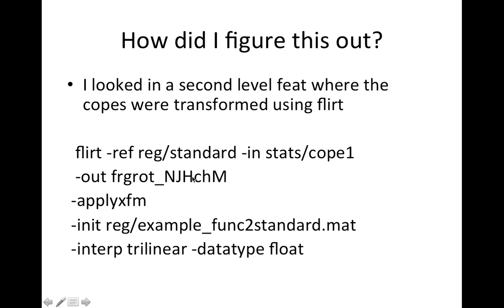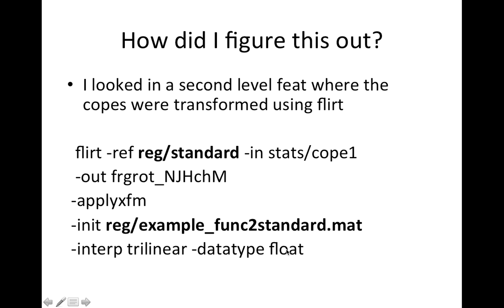The output is a temporary name, because all the copes once put in standard space are concatenated to make a 4D file — the filtered_func_data in the second level analysis. The rest of the FLIRT call uses 'applyxfm', which says just apply this registration .mat file. The .mat file it uses is example_func2standard.mat, with a specified interpolation type and floating point output. The key things to focus on are the reference image and this .mat file.